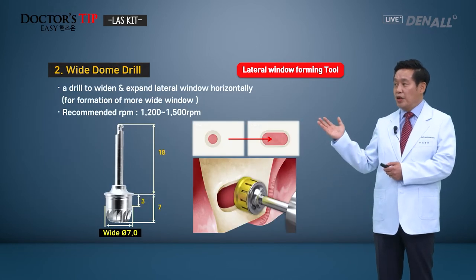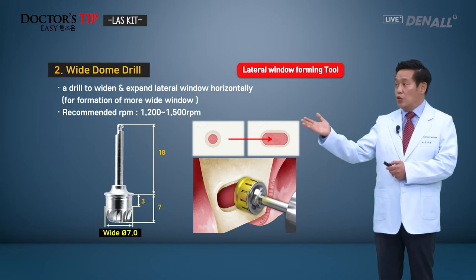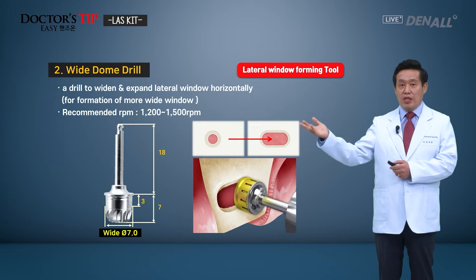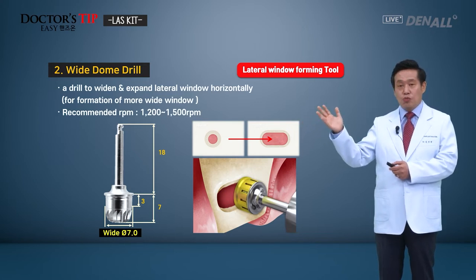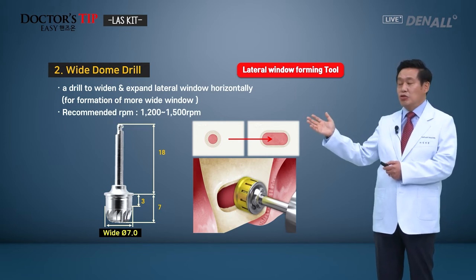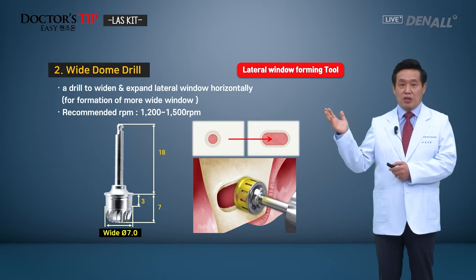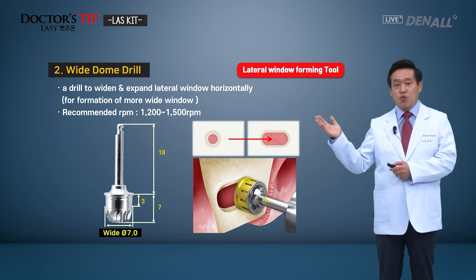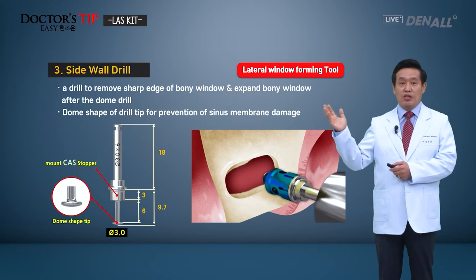Next is the wide dome drill. When you do formation with the dome drill, when you grind, the window could actually be narrow on the center part. If you have a narrow window, you can then use the wide dome drill so that you can widen the lateral window. And if necessary, you can use this tool for further expansion. The recommended RPM is about 1200 to 1500. The width is 7 millimeters.